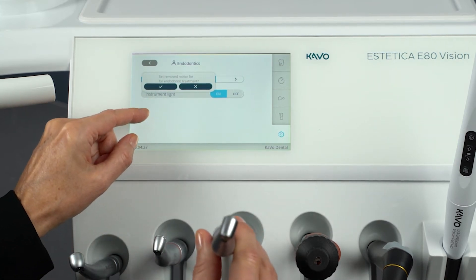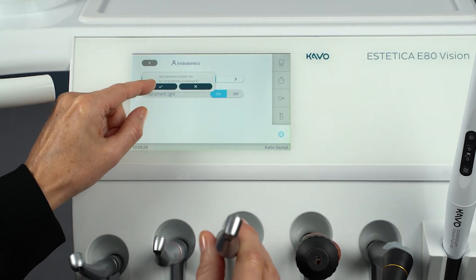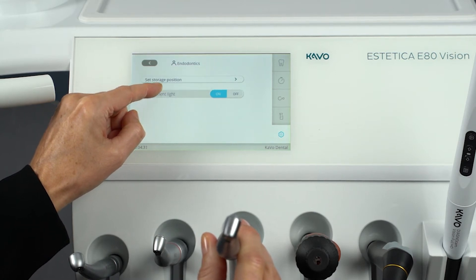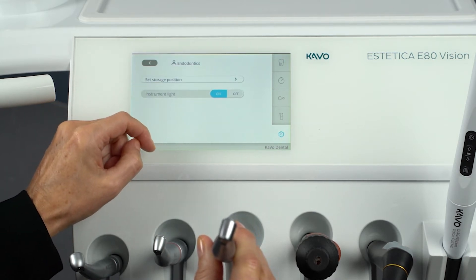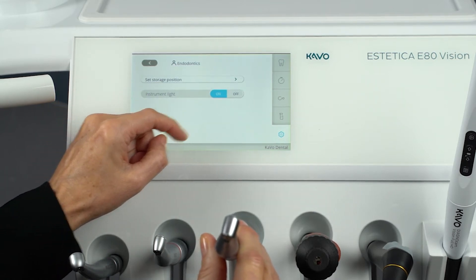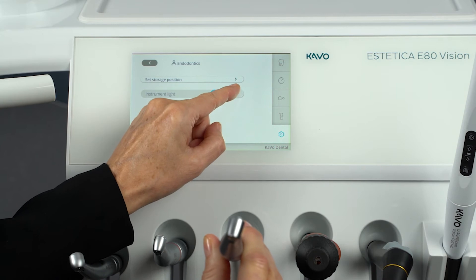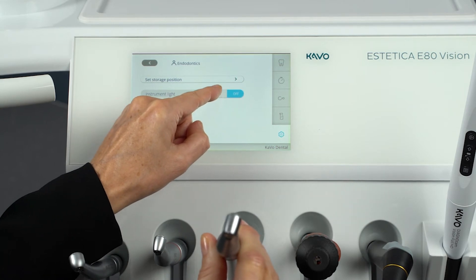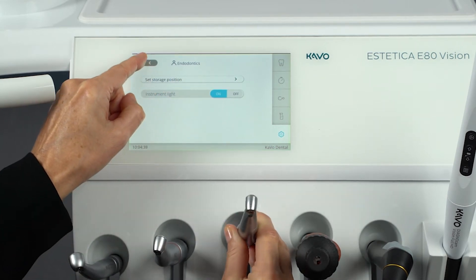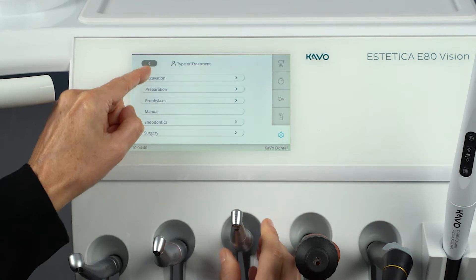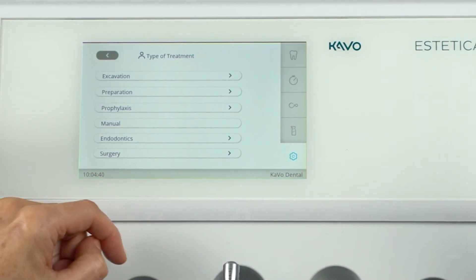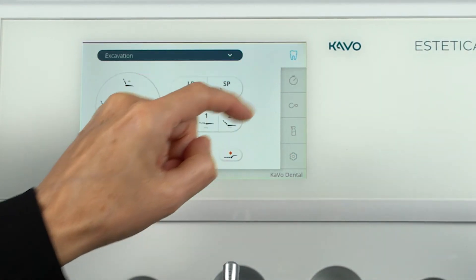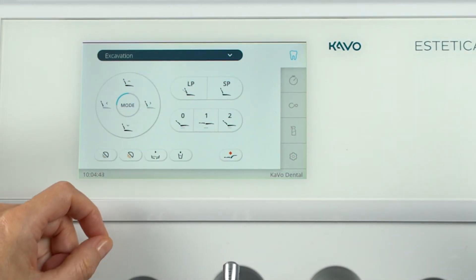After opening the dialog field, take the desired motor for the treatment type Endodontics from the tray and confirm the selection. Put the motor back down after selecting the light setting. The Endo function is now selected for this motor.